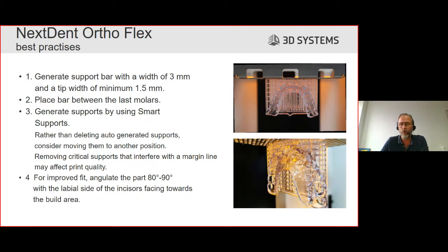First, we generate the support bar with a width of 3mm and a tip width of minimum 1.5mm. You can see that bar in place after printing. We found that placing such a bar between the last molars gives more stability during printing, which means fewer print failures and better accuracy. We aim to achieve the highest accuracy possible and placing this bar helps.